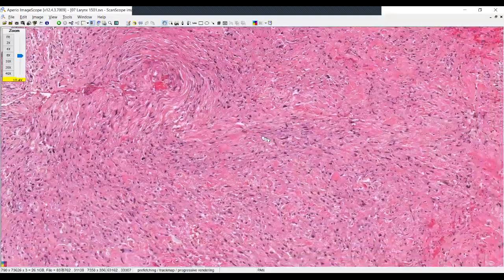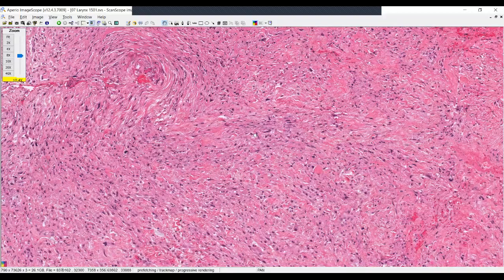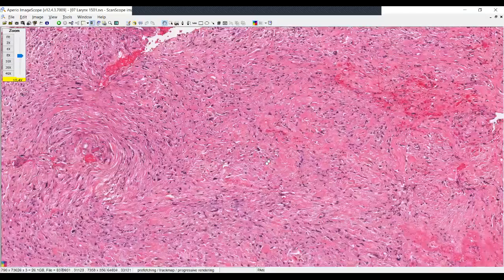In general, those are much more arranged with collagen that has a keloid-like appearance and a much more refractile quality to it, and generally no atypia. You could, of course, do a STAT6, and that would help you in the diagnostic category.